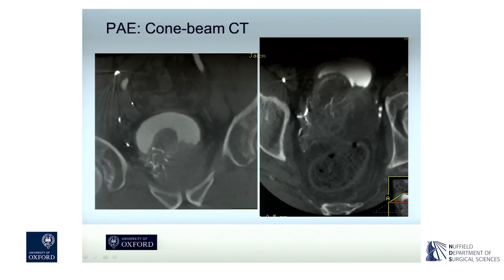Another patient this time, we're in the right side of the prostate gland, contrast enhancement within the right side of the gland, prominent median lobe with enhancement. We know that if we embolize from here, we're going to infarct that median lobe, and this is probably the thing that's been causing the patient their symptoms. No uptake in the bladder.